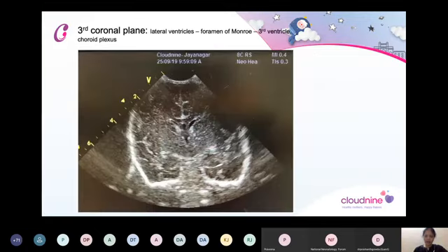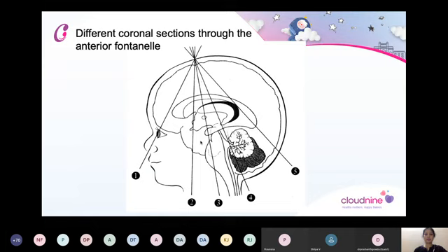And then if you see this clear, bright image over here near the medial side of the germinal matrix, that's the choroid plexus, and that is where you would see a bleed if it occurs. And the bleed would be almost as bright or a little brighter than the choroid plexus.